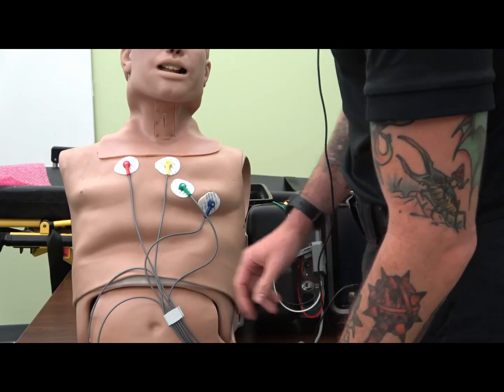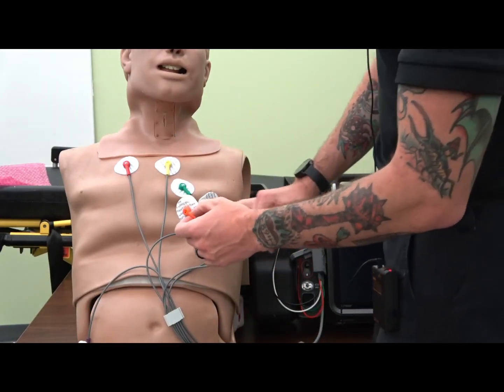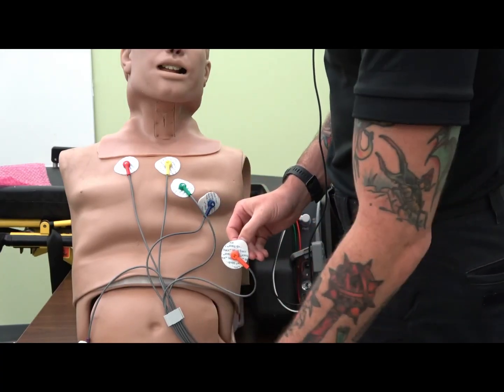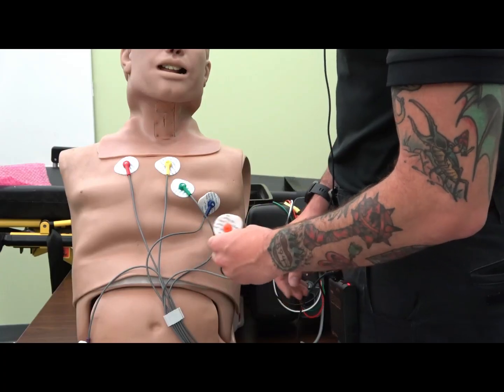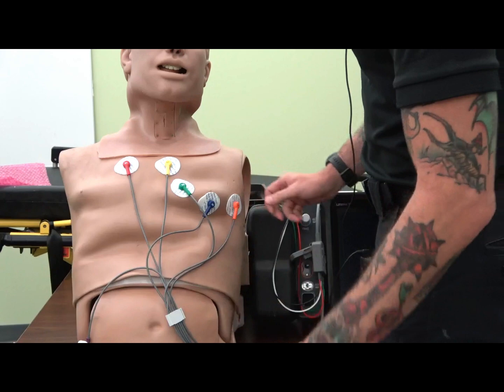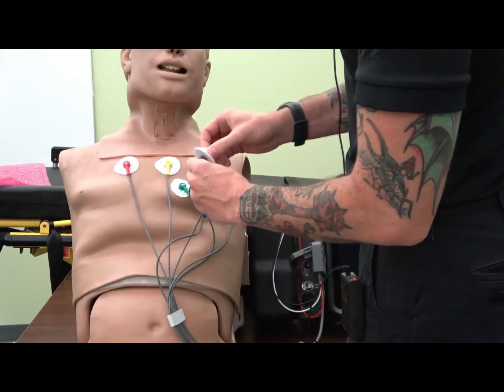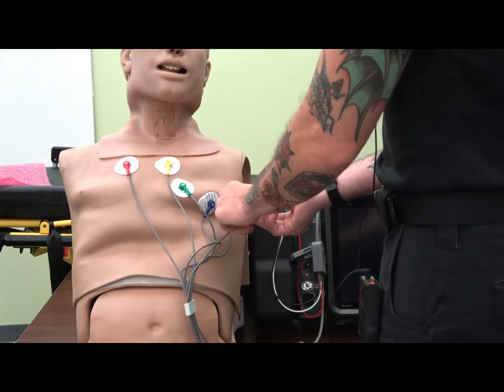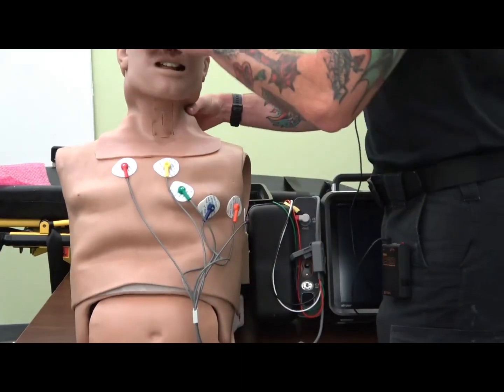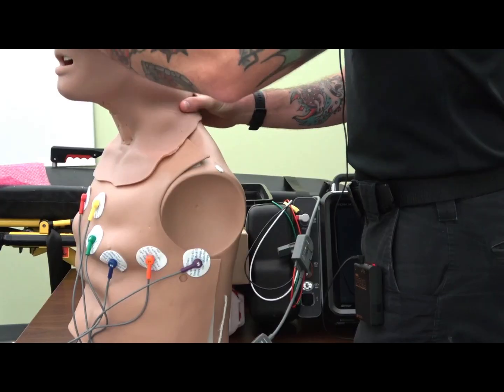And then we're going to go to V5, which is going to be on the same plane as V4, although it is going to be at the left anterior axillary line. And then V6, which is going to be mid-axillary line, same plane, which you can't really see here. I got V6 right there.